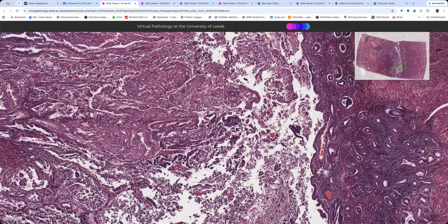I tend to overestimate the solid. All right. So the question I was asking was, can we tell cytologically the difference between FIGO grade 1 endometrioid adenocarcinoma and atypical hyperplasia? No, we can't. Well done. We can't, because we can't tell whether it's invasive or not. So cytologically, they're the same. So we have to look for the patterns.